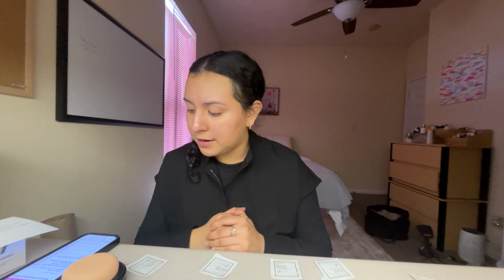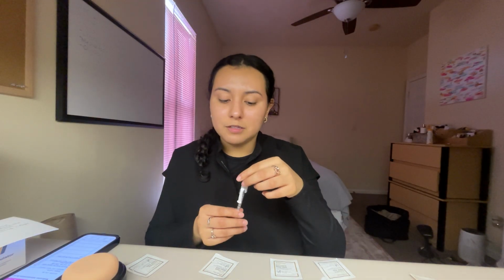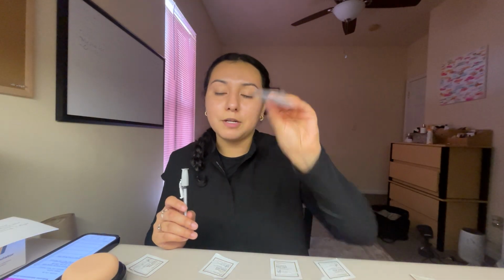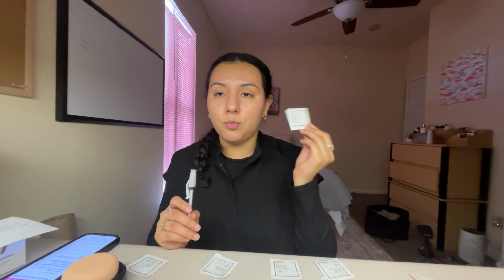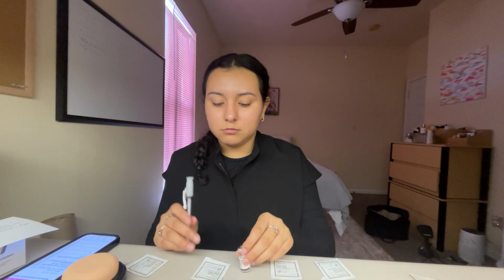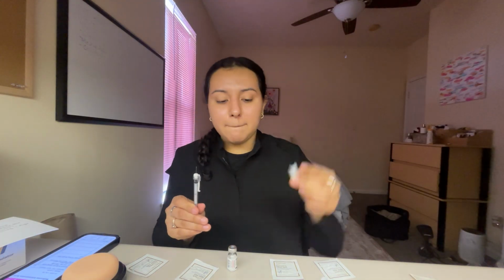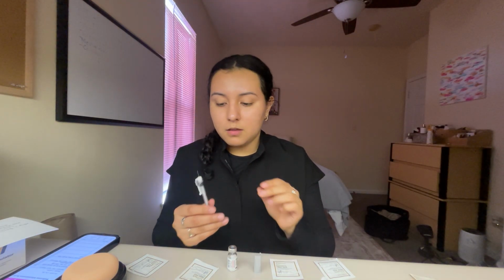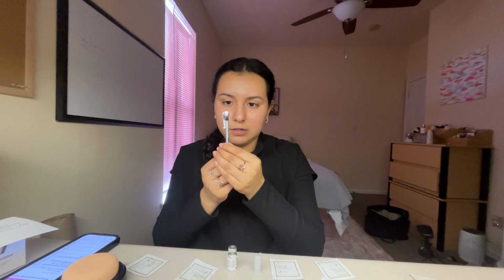Then it says I have 0.1 milliliters in my TB syringe. So again, I'm going to wipe the self-sealing stopper top with my alcohol swab, and I'm going to let that dry. Then I'm going to remove my cap, and I'm going to aspirate 0.1.